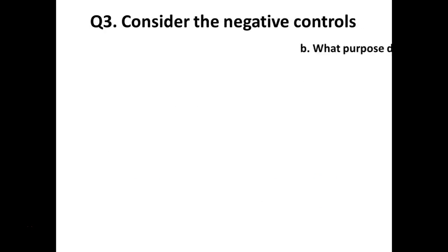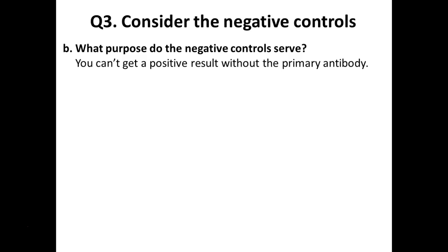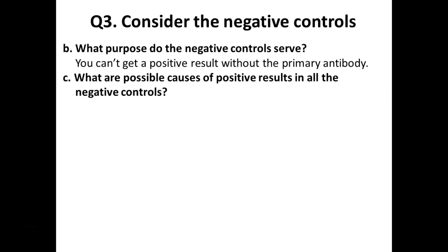And this is to help us prove that without that antibody, this test should be negative. Right? So it's just buffer solution that I'm giving you guys. No antibody in it. So what happens if we get positive results in our negative wells?